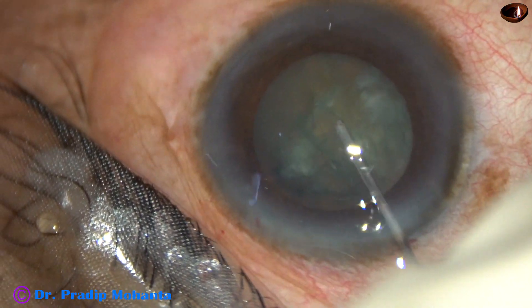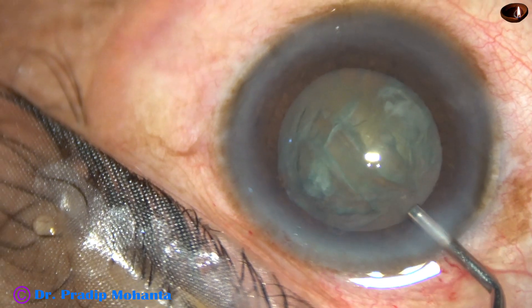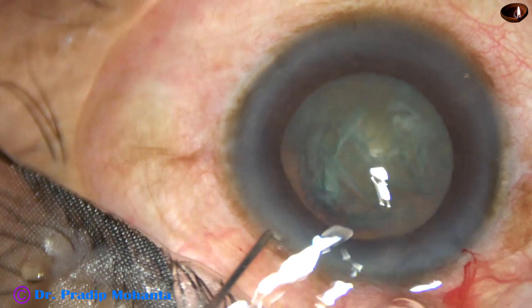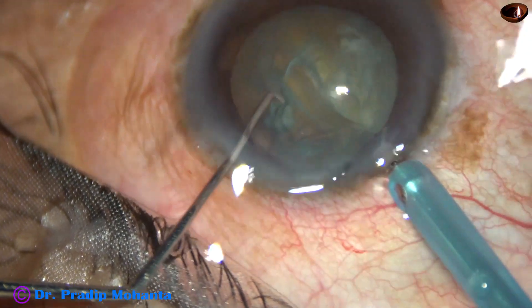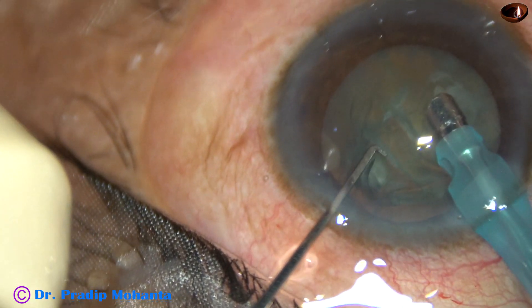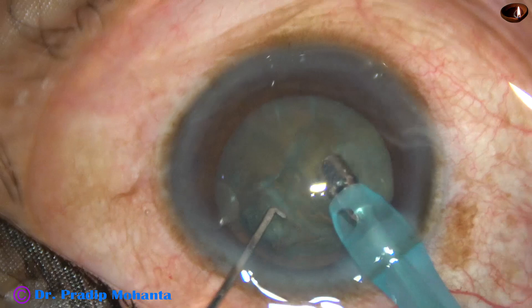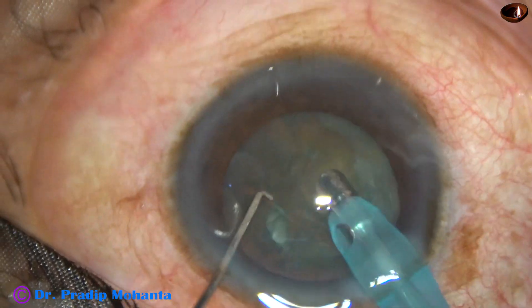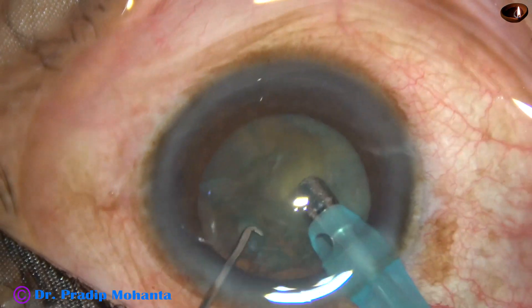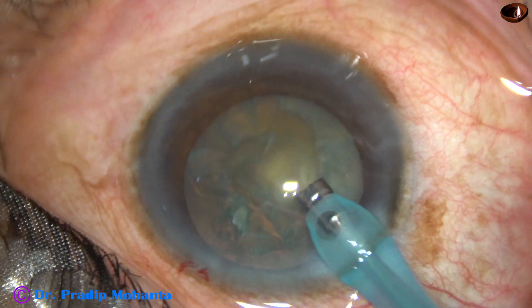In this case, the hydrodissection has been done and now some 2% HPMC is injected into the anterior chamber. Now we are going to see mechanical chop in slow motion — this is 50% speed. The tip of the phaco handpiece is introduced. Some superficial cortical lens matter is aspirated so that we can judge the depth of the pit that we are going to make very accurately, and the cortex doesn't obscure the visibility.